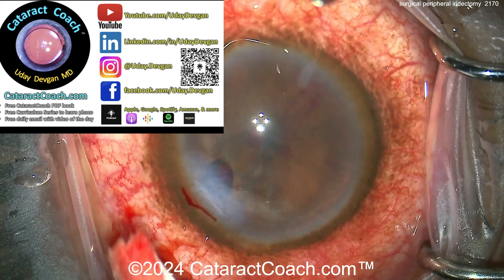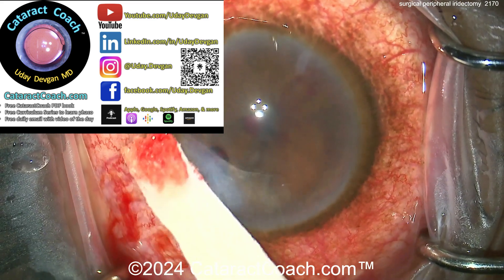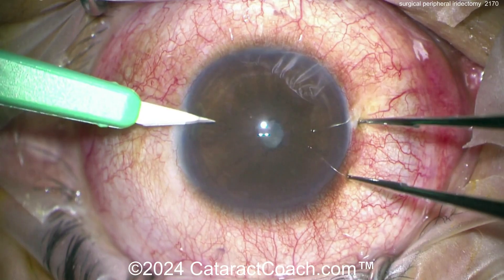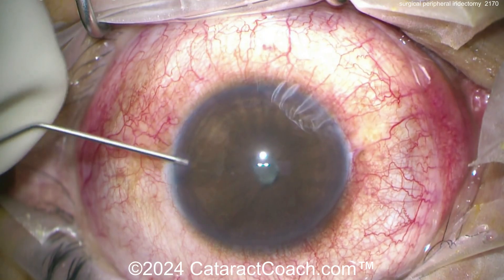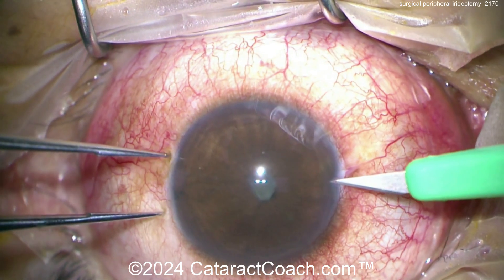For more on cataract surgery, check out the free website cataractcoach.com, the weekly podcast, and Instagram. Now let's change gears to a peripheral iridectomy made with the 23-gauge vitrector. Here's a little pair of incisions and a small amount of viscoelastic just to deepen the anterior chamber.